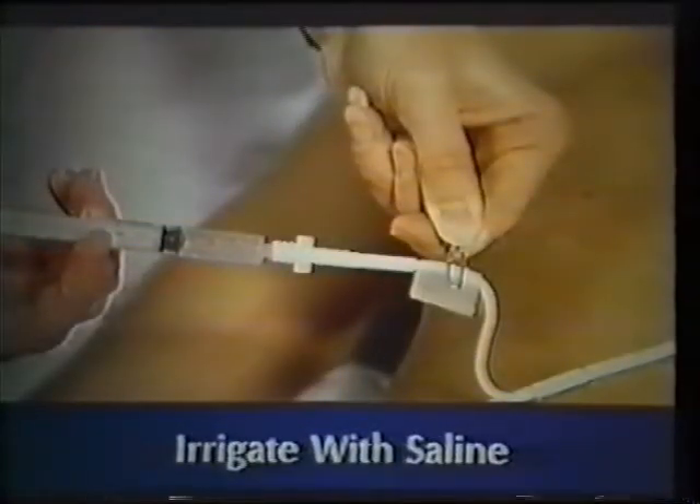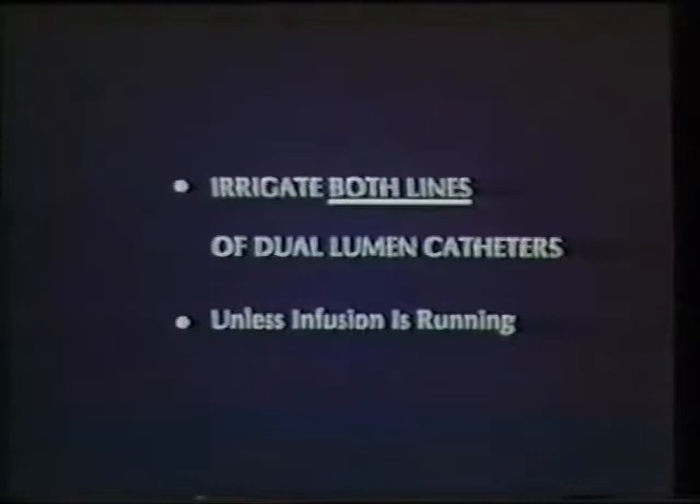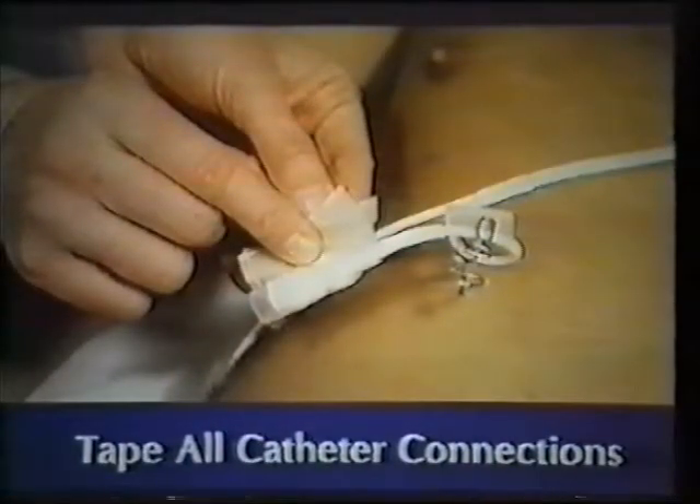Now irrigate by connecting the 3 milliliter syringe filled with saline to the catheter. Remove the clamp and inject the saline, then replace the clamp. Inject the blood into the labeled tubes. If the patient has a dual lumen catheter that is heparin locked, you must also irrigate the side not being used for blood drawing. It is not necessary to irrigate if there is an infusion running in that lumen. Cleanse the outside connection with an alcohol wipe. To resume an infusion, reconnect the IV tubing and remove the clamp. If an infusion is not started, heparin lock the catheter through a newly placed injection cap. In either case, tape the connection with 2-inch plastic tape and secure the catheter to the patient's gown.